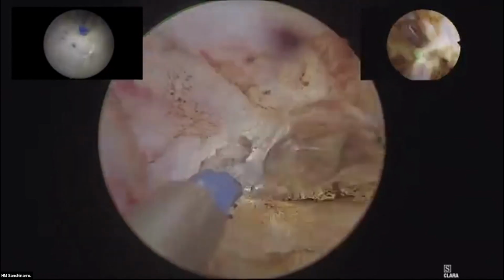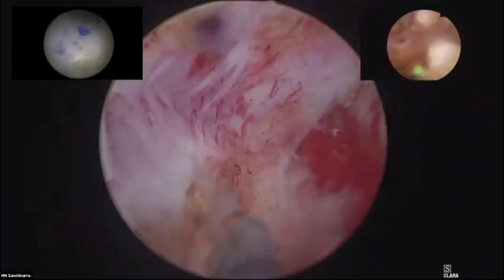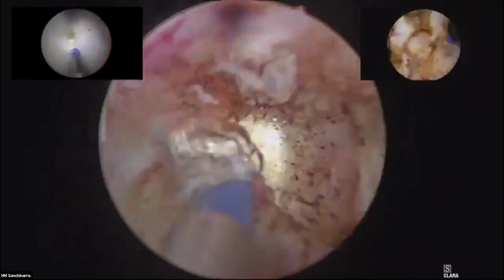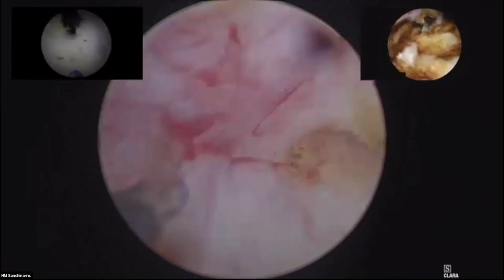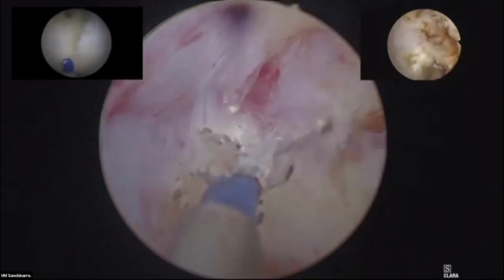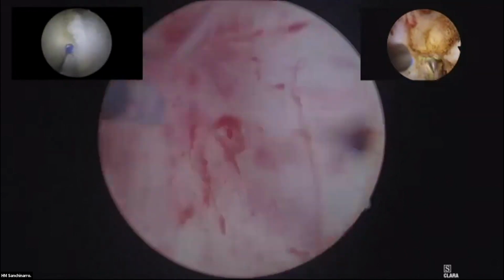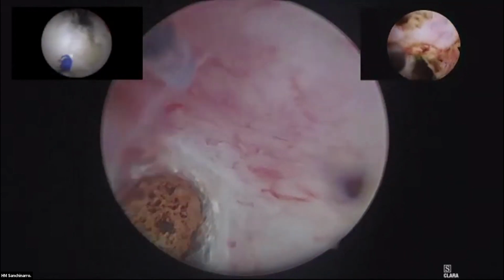So usually the second lobe, the right one, even if the position of my hand is not the one I would prefer, is easier to enucleate because you have no contraction on the other side, because the other side is empty, and so I can make better traction on it. You see, it's very easy to enucleate it, because you don't have anything on the other side that makes you... Exactly. Yeah. That is what we were talking about, the ThuLEP technique and its advantages, with Jose Placer in the other operating room. You have more room to mobilize.